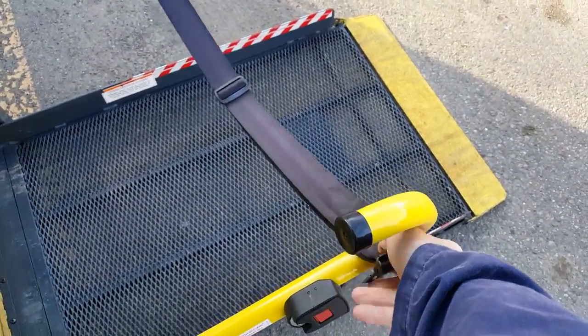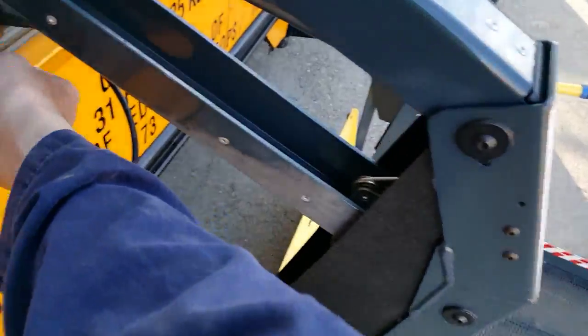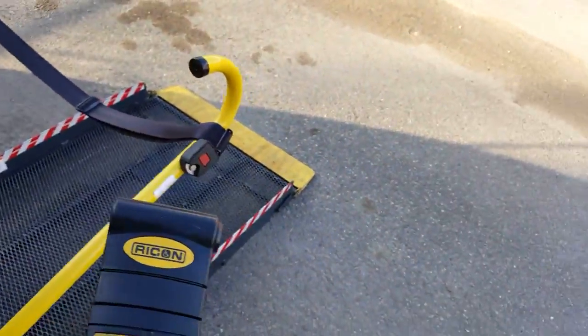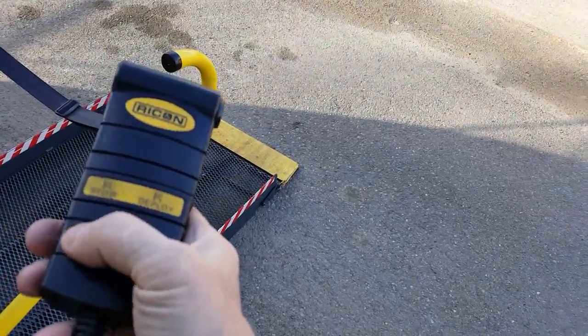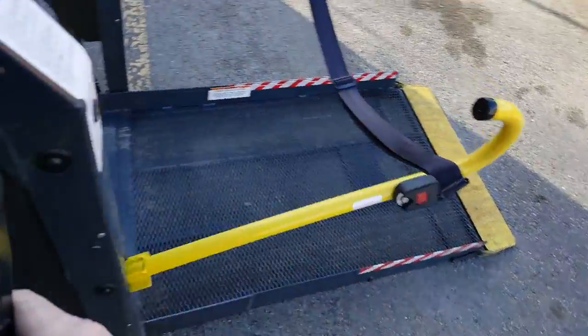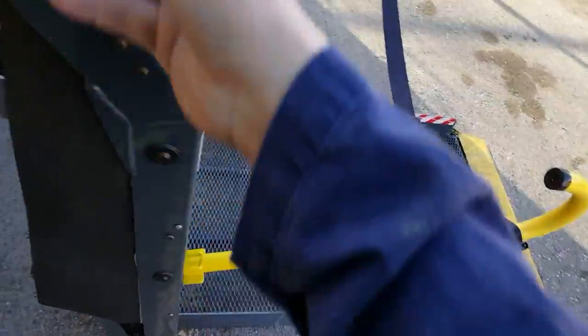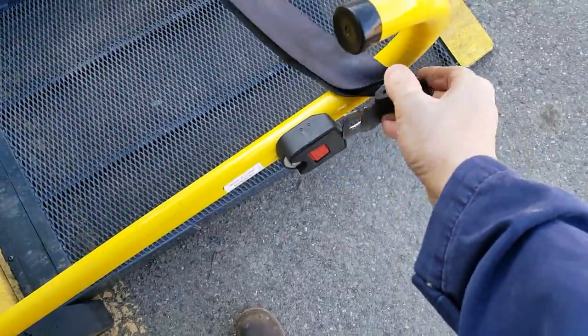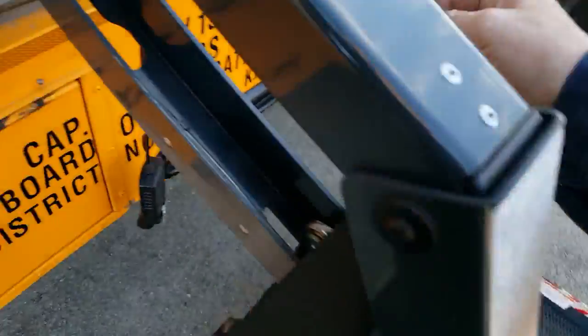It will not operate — it locks it out, nothing happens. We'll go back up. It's a good idea, it's a safety thing. Okay, up we go.